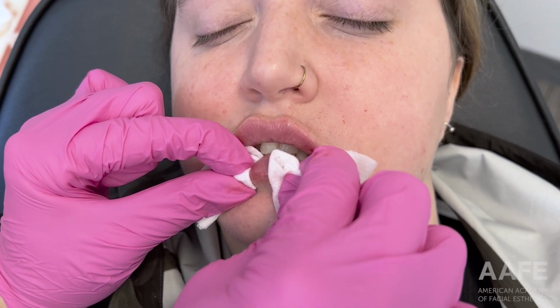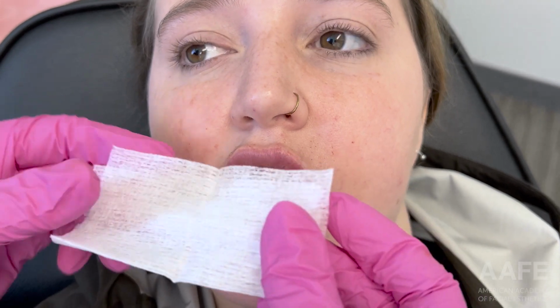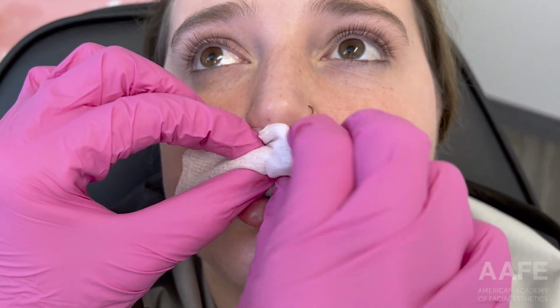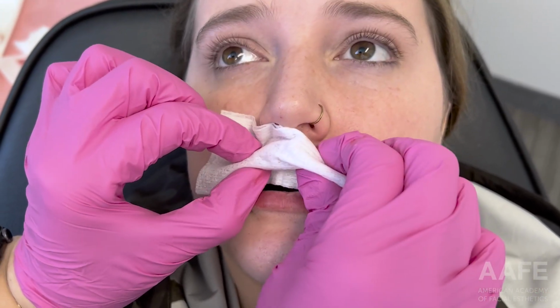So we haven't quite used the whole thing, but we'll take a peek and see where we need to add a little bit more or massage. When I massage, everyone does this a little bit differently, but I like to take a gauze and roll it like a hot dog. I learned that when I was young. This is hamburger way, this is hot dog way. So I wrap it like a hot dog, and I'm just giving gentle pressure to feel if I feel any obvious lumps or bumps, and I don't.